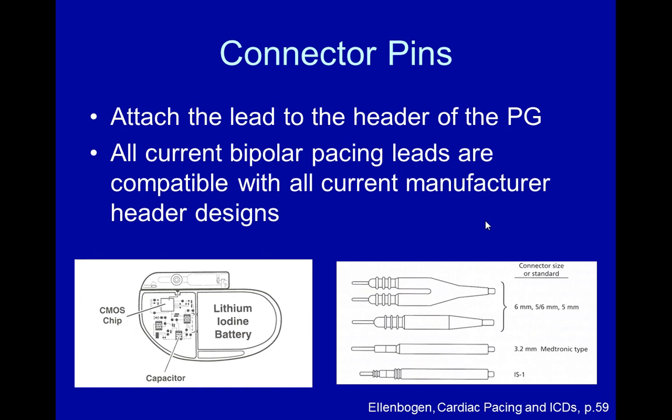And that may just be because the patient had a Medtronic pulse generator and Medtronic leads 6 years ago. And the battery of that Medtronic device was low. They replaced it with a pacemaker that may have been more specifically designed for that patient, that may be a St. Jude device. And the concept here that I want you to take home is, when you look at someone's record, make sure you determine what the manufacturer of the pulse generator is, not necessarily the leads. And that's because you have to use a specific programmer for that pulse generator. So if you have a patient with a St. Jude pulse generator and Medtronic leads, you have to use a St. Jude programmer, not a Medtronic programmer. Okay, and we'll obviously talk about this more in the programming section.